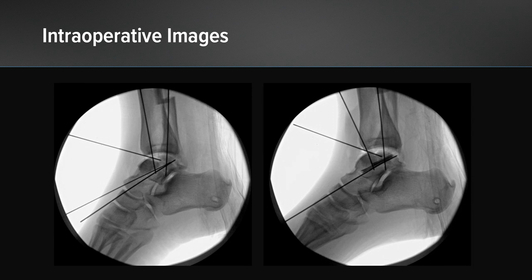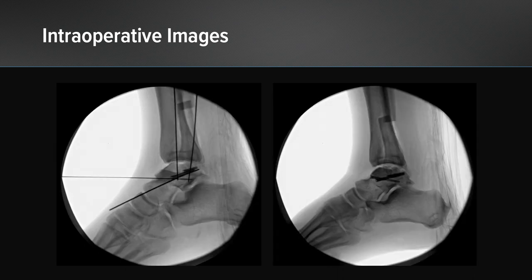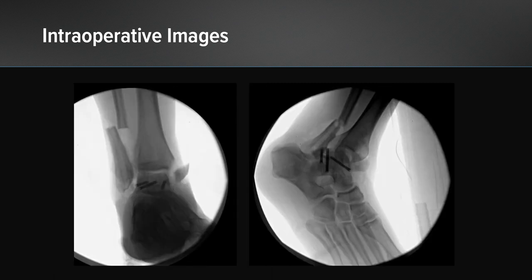As we progress with fixation, we use Trimit pins for fixation of the isolated chondral fragments with bony association too small for screw fixation, and subsequently place headless compression screws for fixation of the larger bony fragments. Additional screws are placed and the overall shape of the talus is being recreated.